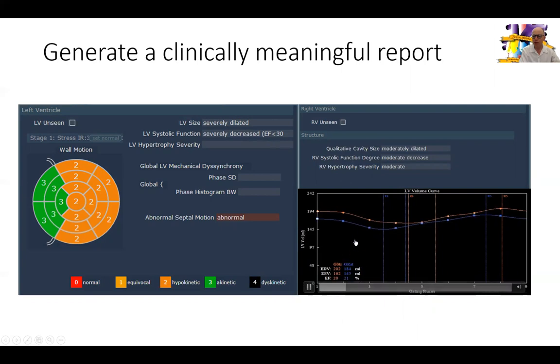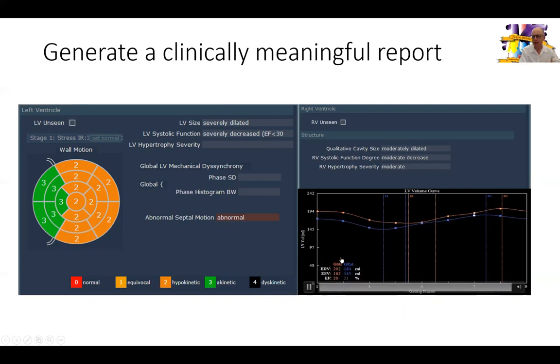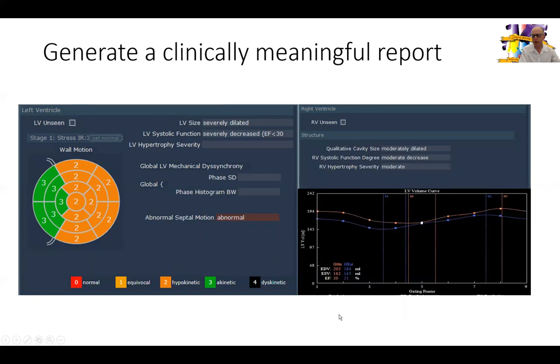Here are the volumes we report. It is important to report volumes — in our experience and in small series, they correlate very well with what is considered the gold standard by MRI. These volumes by PET are extremely close to what you get by MRI. A lot of prognostic data can be derived from end-systolic volume index if you are doing clinical follow-up on these patients or planning prospective or retrospective studies on your database.